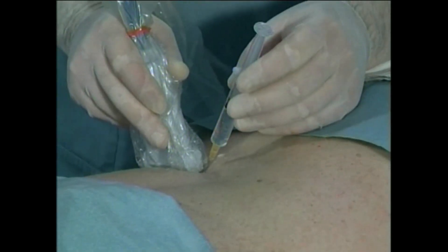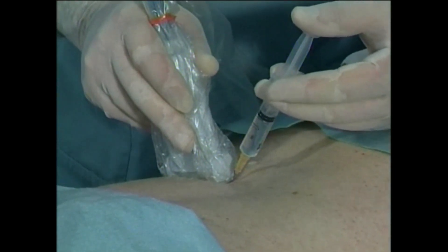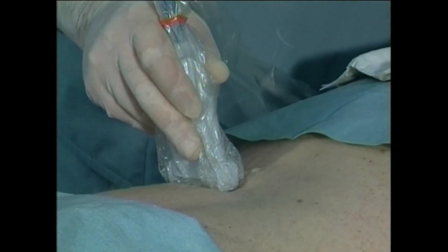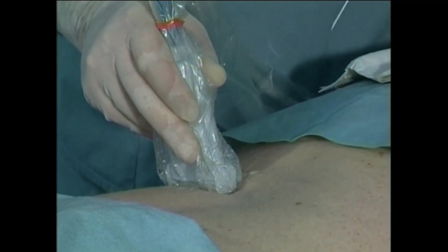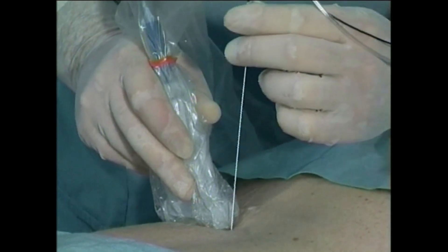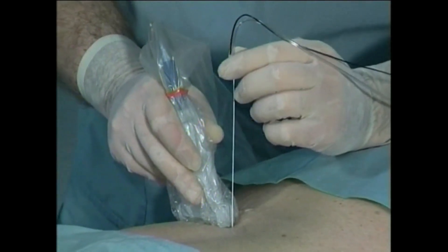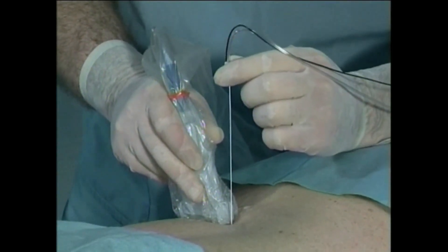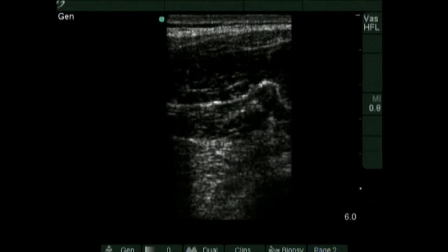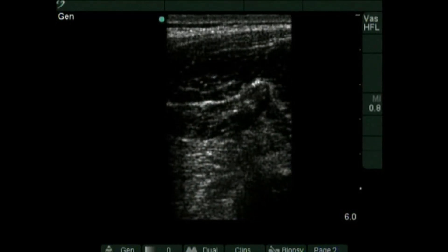At the medial edge of the probe, create a skin wheal with 1% lidocaine using the 25-gauge needle. Proceed to insert the needle into deeper tissues and inject additional anesthetic following negative aspiration. Insert the 22-gauge, 120-millimeter insulated needle perpendicular to the skin through the cutaneous wheal, keeping the needle aligned with the transducer. Identify the needle tip on the ultrasound screen and advance the needle under real-time imaging between the transverse processes of L4 and L5.